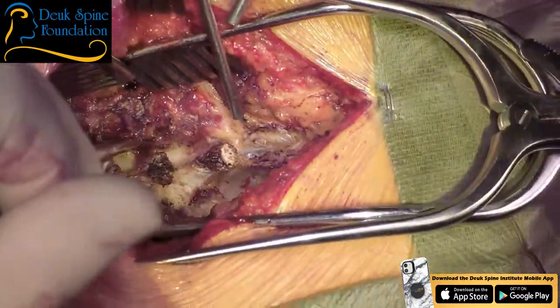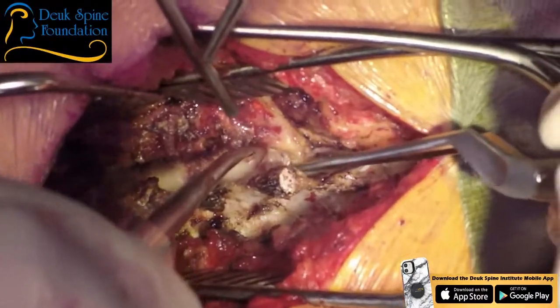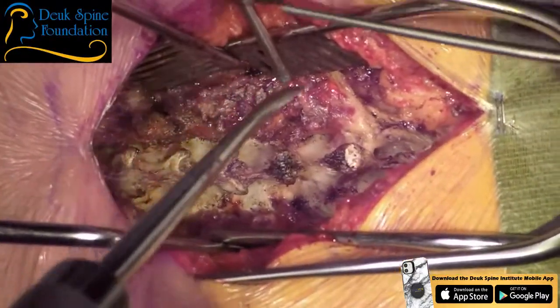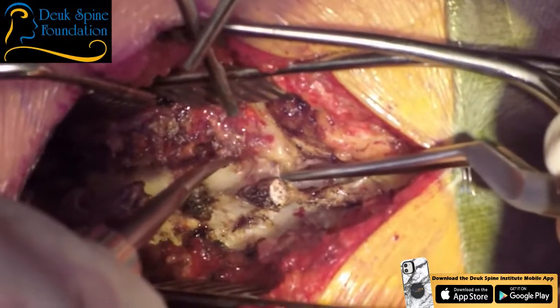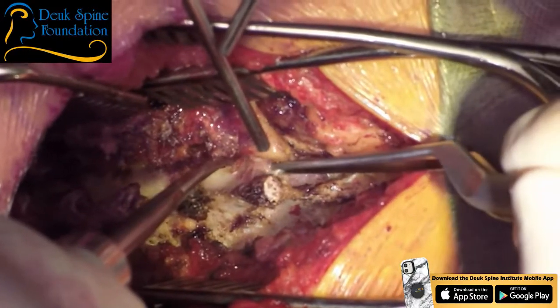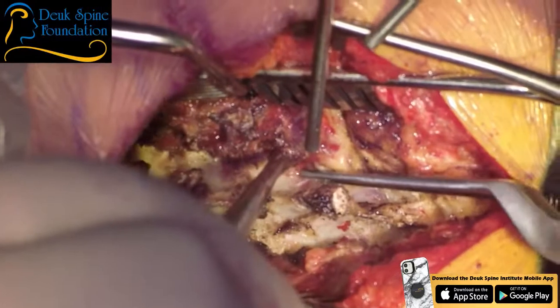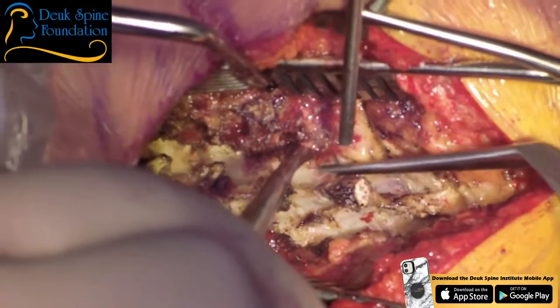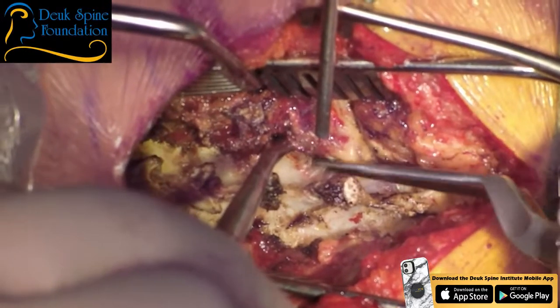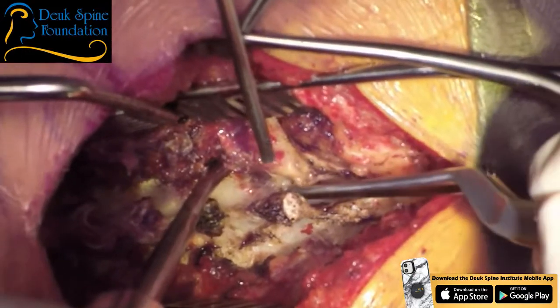So when I get down to C7-T1, T1-2, the blood vessels, typically the arteries and veins that run between the interspinous ligament, between the spinous processes, get pretty robust. So I always like to come in and coagulate them with a bipolar first. Otherwise, you'll be chasing them out laterally into the muscle once you dissect it with the Bovie, and it bleeds and bleeds and bleeds. So you can avoid a lot of blood loss just by using your bipolar at the bottom here first.